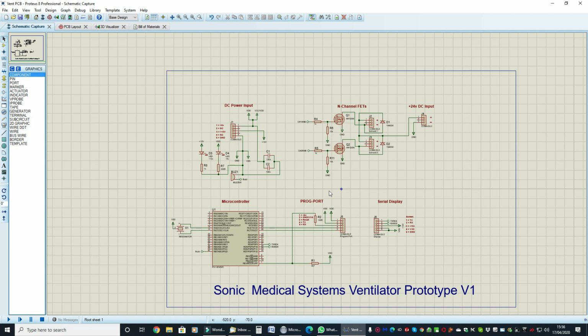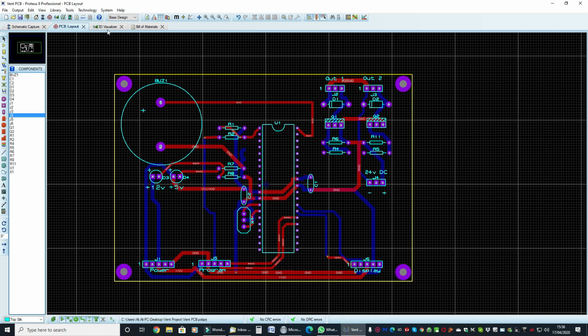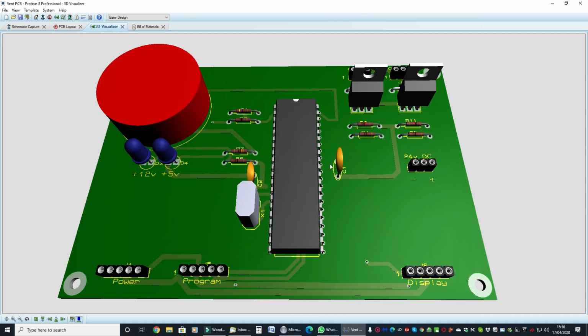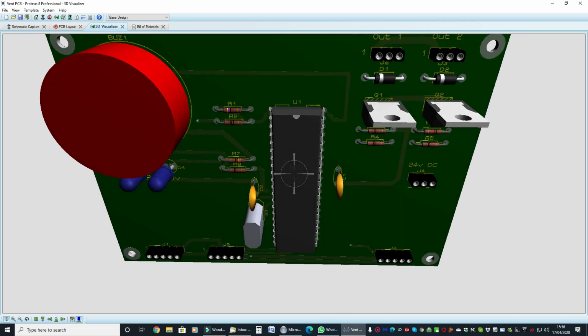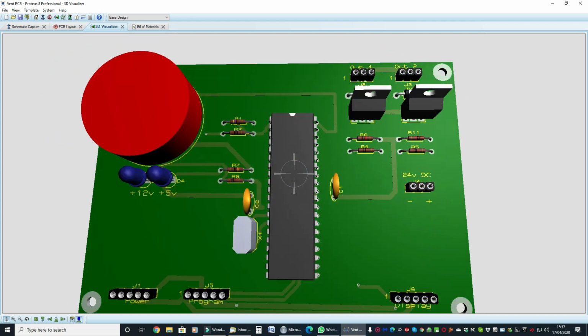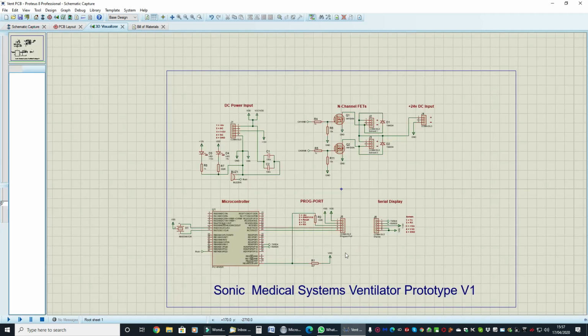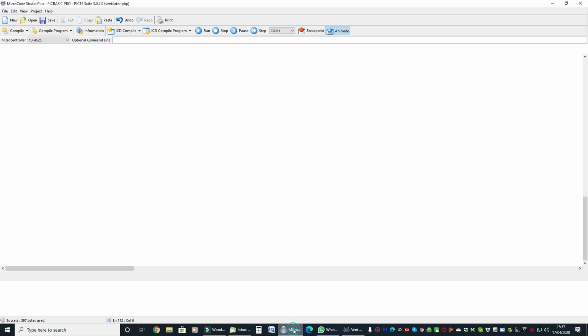So that's the basic circuit, and it looks something like this. And let's do a 3D visualization. So it's going to be something like this, very simple because it's early stages. It's just to begin the automation process. Let's have a look at the code.